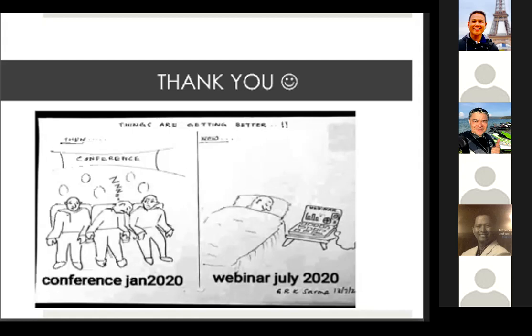Do you expect sensation or no sensation? What if he is diabetic, sir? There should be no sensation, delayed sensation, with a large volume. At what volume? Volume of first sensation.